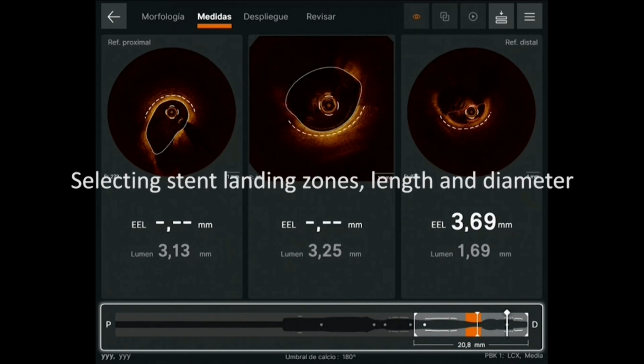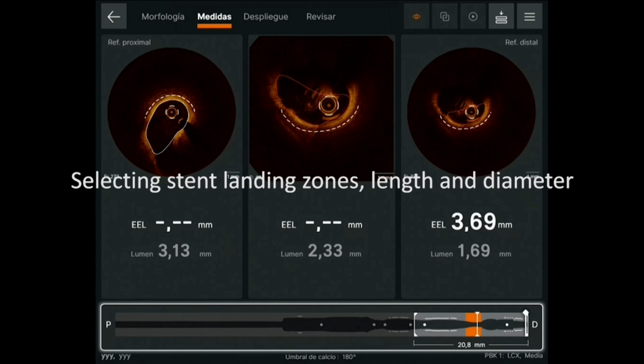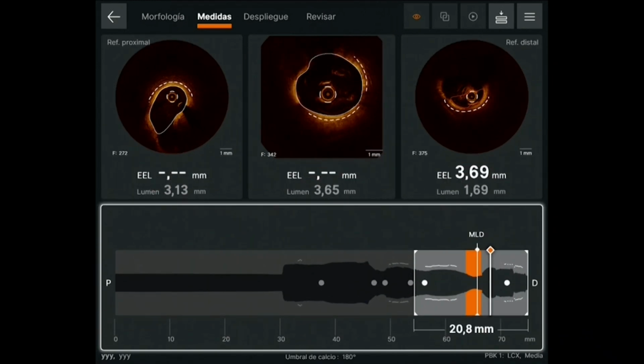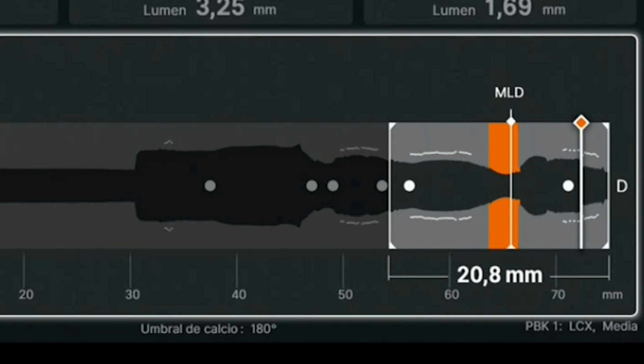I'm going to move now in the pullback to select a region for distal landing. Perhaps we could also zoom the profile, Nieves, because then we can show the colleagues that in the profile you now have these white lines that run parallel to the lumen of the vessel. This is the external elastic lamina. So you have an appreciation of the size of the vessel at that particular location, whenever it is possible to identify it. Maybe around here we could select our distal landing. There is some disease at this level, but there is a very big lumen area at this point, so probably we don't need to go much farther or go to the bifurcation.